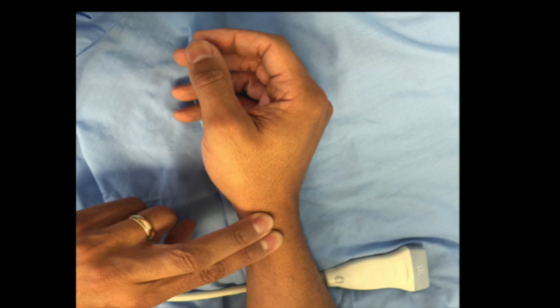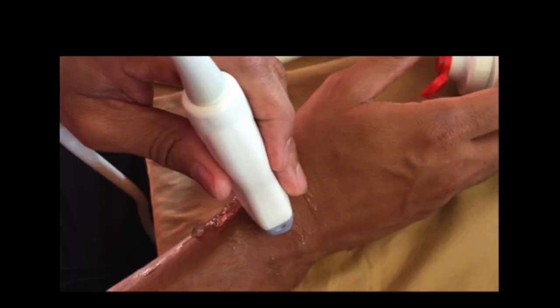The end of the radius is palpated, and then a site is marked 2 finger breadths above the end of the radius. Axial imaging is then performed to evaluate the tendons of the 1st dorsal compartment. The pressure of the transducer may cause discomfort in patients with de Quervain's tenosynovitis.